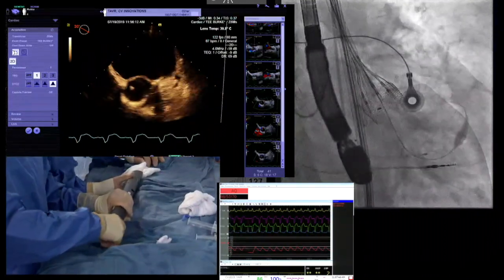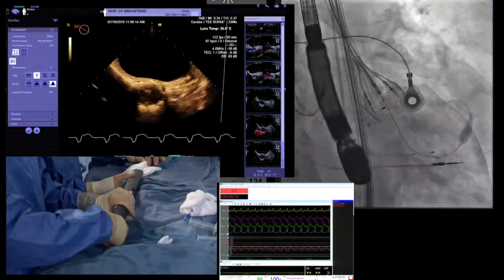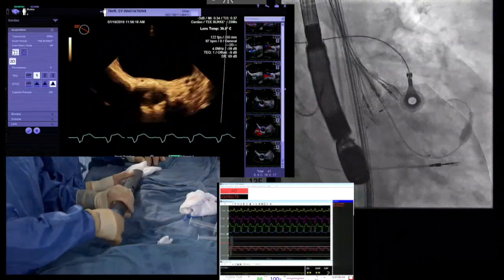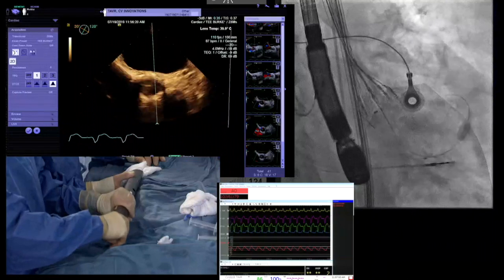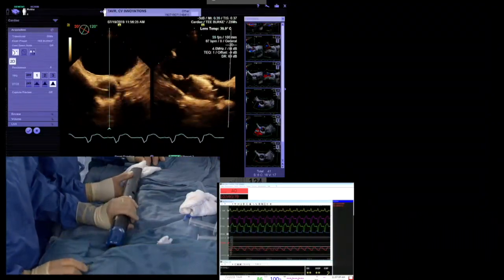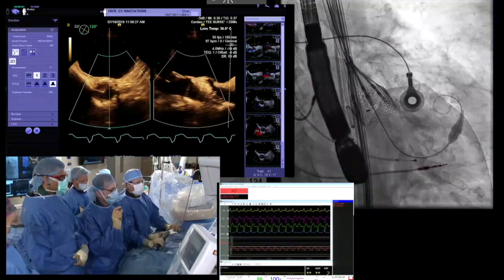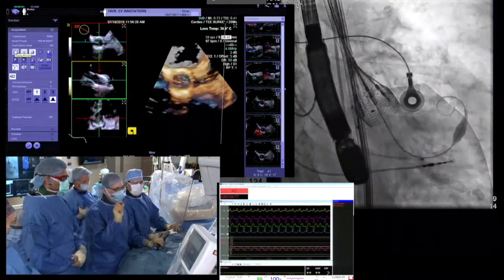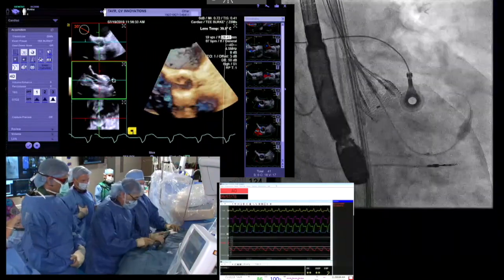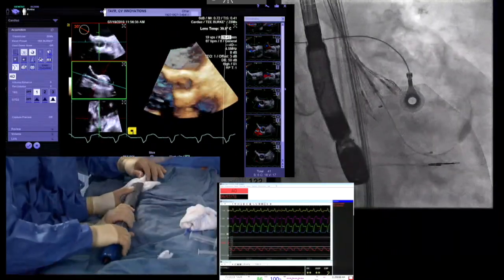So now I'm going to go counterclockwise to end of travel with this bluish green knob. And now I'm at end of travel. When that happened, fluoroscopically you can see a little daylight between those two markers. So between the buckle and the post, you're going to get a hint of daylight, as Dr. Riley said. Now, the next thing is to move our collar forward, so we go to release.